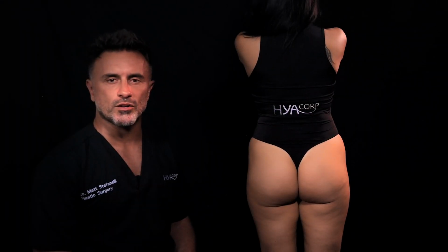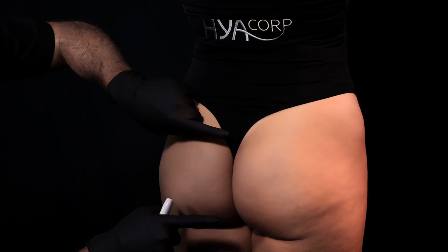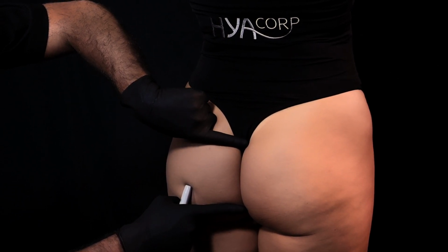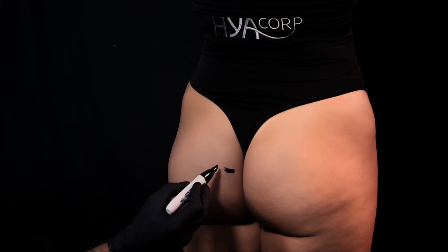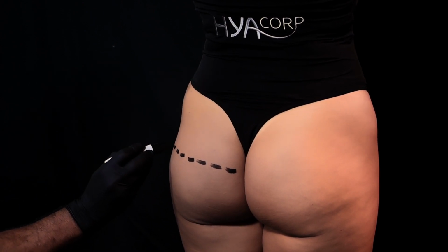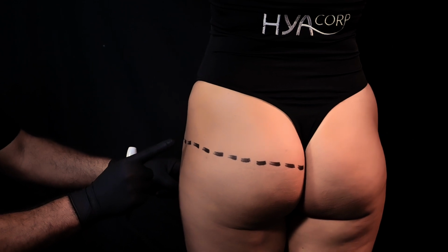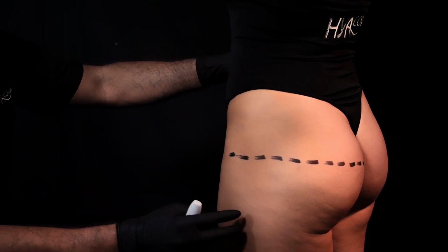Now we are ready to start the markings. I will use first of all a black marker to place some anatomical landmarks. The first one is the horizontal line, which is corresponding to the half of the intergluteal cleft. And I'm going to the front. Why is this line important? Because it gives the maximal projection of the hips. And I'd like also to mention that it should correspond to the pubis on the front.